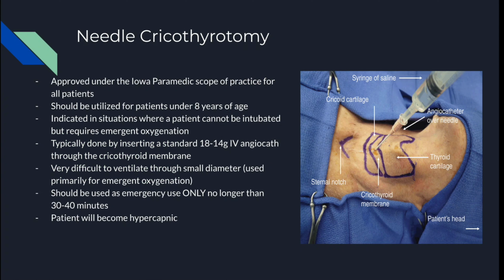Now, that being said, since we can't really adequately exhale for the patient, this procedure should only be used for 30 to 40 minutes tops. That should be enough time to get to an ED where they can utilize some other means.